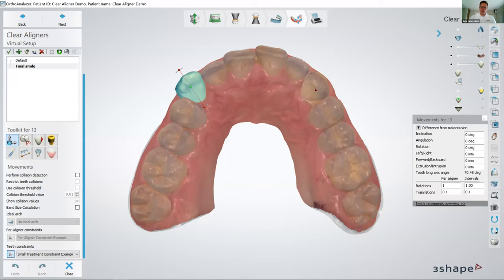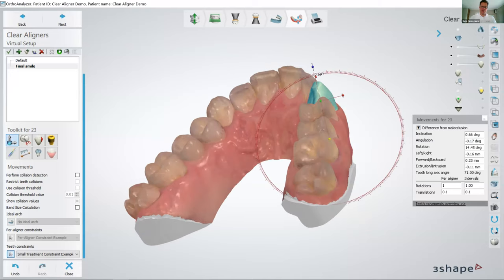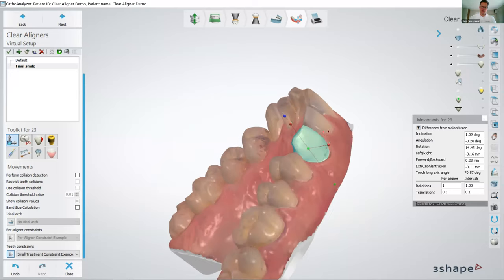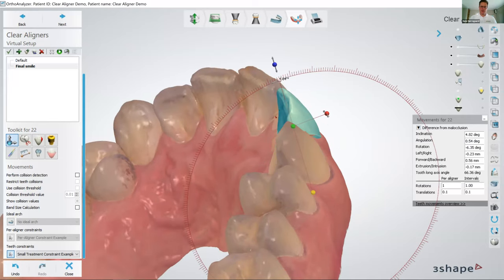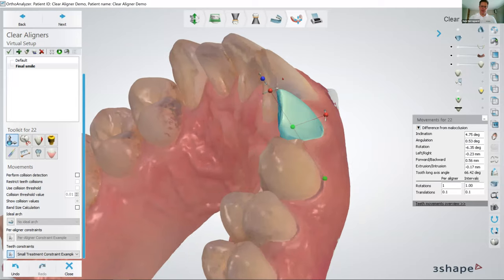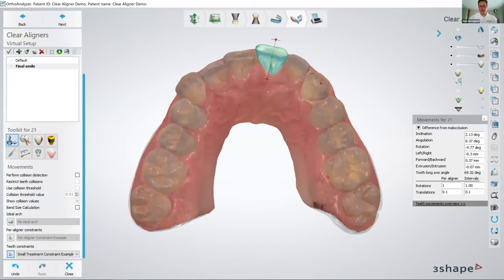The way that I approach it now is that I'm actually not really thinking about if I'm creating collisions or if the movement is not done in the right sequence, because for this way of doing it, I'm simply just aiming for the final smile, and then I work my way backwards from there.